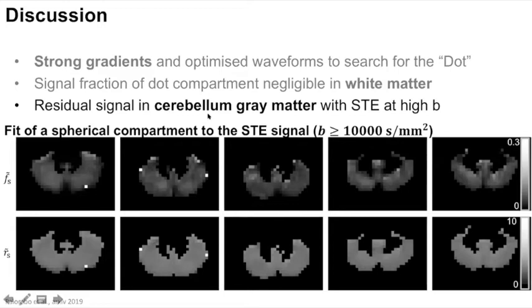When we use, again, the same signal to get a size estimate of this compartment, we found that the size estimate is about 4.5 micrometers. But note that these waveforms were never really optimized to avoid, for example, exchange regimes or anything.